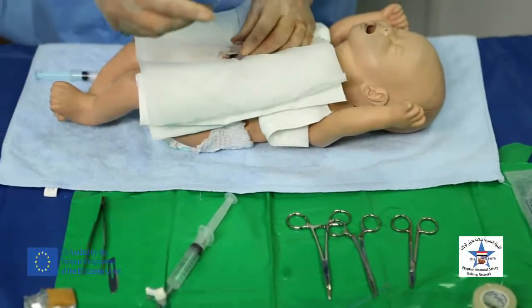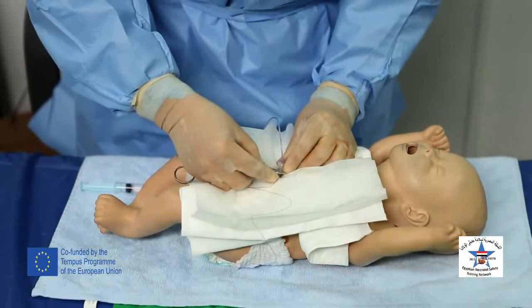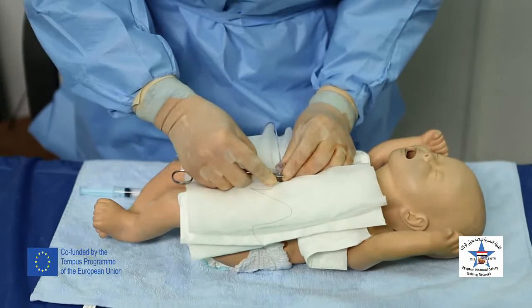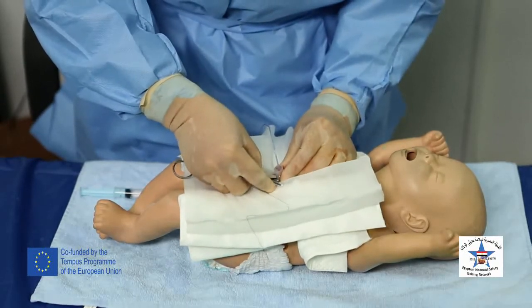Stitch the umbilical vein catheter to the umbilical stump, taking care not to puncture the wall of the vessel.